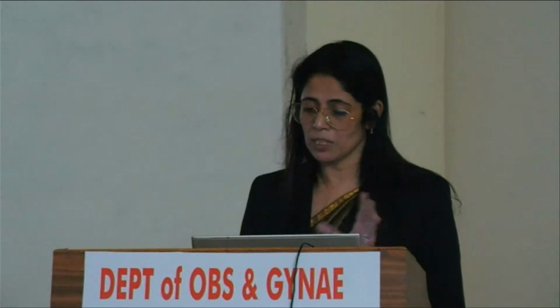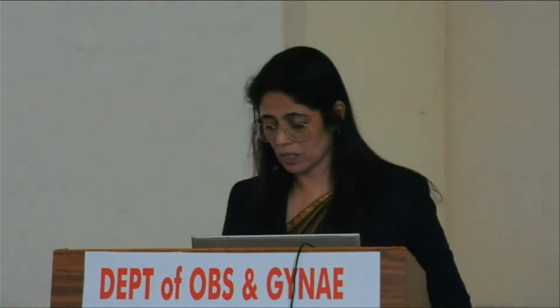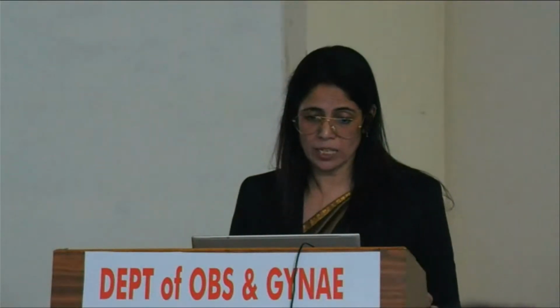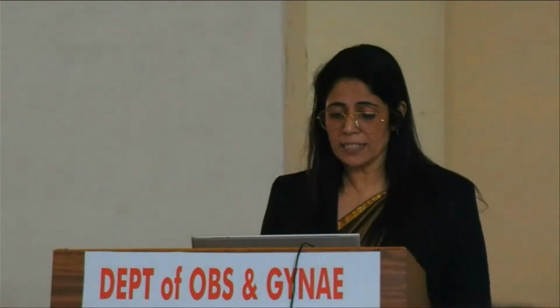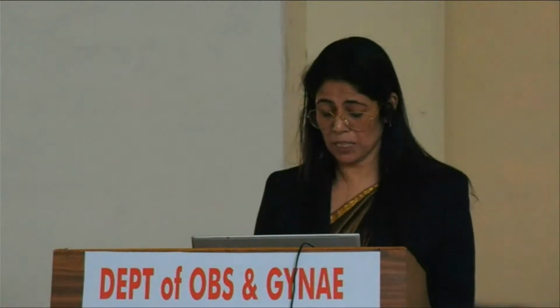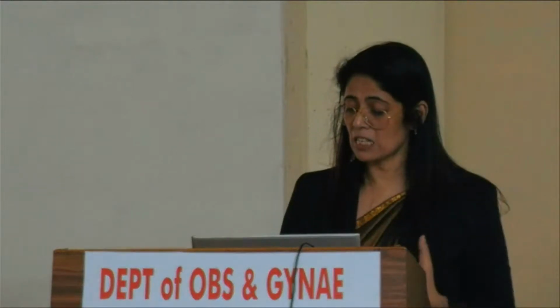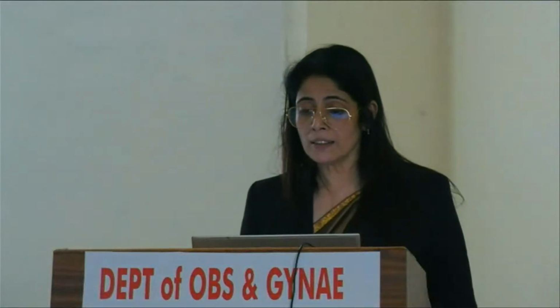But frankly speaking, it is not very much used, and we usually depend on the 20 weeks anomaly scan to look at the size of corpus callosum agenesis. While we were talking about effaced intracranial translucency, sometimes we see that the intracranial translucency might also be widened, and this is an early marker for posterior fossa anomalies. So this was a case of T21 with posterior fossa anomalies, an enlarged intracranial translucency, megacystis, and a lot of other findings, and I shall show it towards the end of my talk.